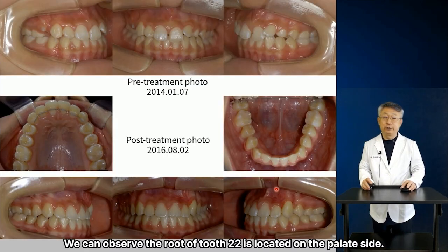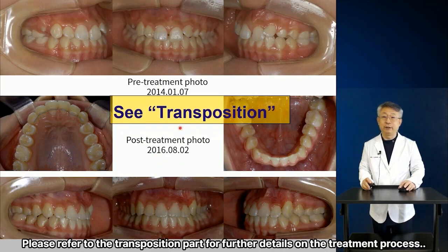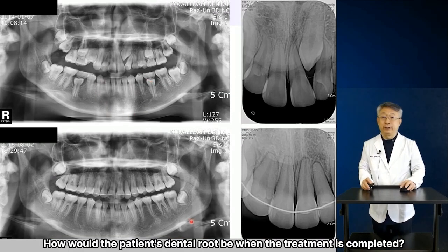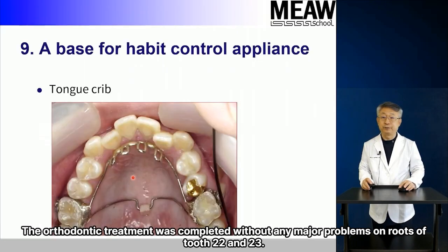We can observe the root of tooth 22 is located on the palate side. Please refer to the transposition part for further details on the treatment process. How would the patient's dental root be when the treatment is completed? The orthodontic treatment was completed without any major problems on roots of tooth 22 and 23.